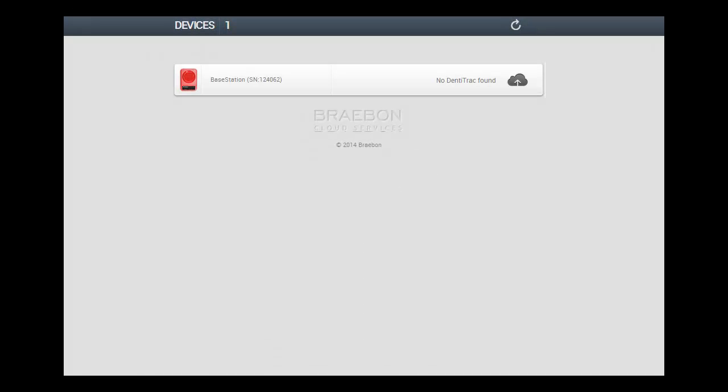Contact your oral appliance provider if any upload problem persists. Number seven, if the dentitrack data does not upload after a second attempt, reposition the appliance within the sweet spot zones and make sure the dentitrack is downward facing towards the center of the base station. Click Upload again to retry. Contact your oral appliance provider if any upload problem persists.